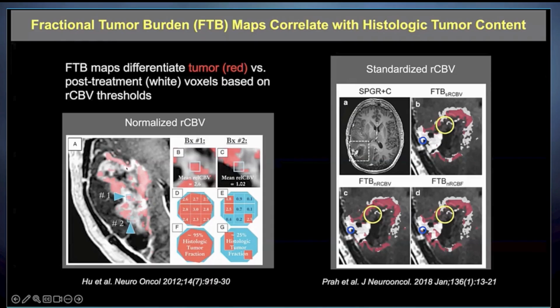And so it gives us a good understanding that it's very difficult to lump these large enhancing lesions as either one or the other. Meaning, would we put it in the tumor category or the post-treatment effect category? That's a question that probably needs to be addressed by the neuro-oncology community in the future.